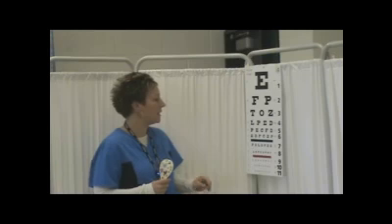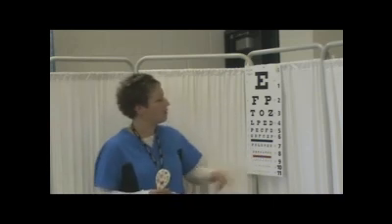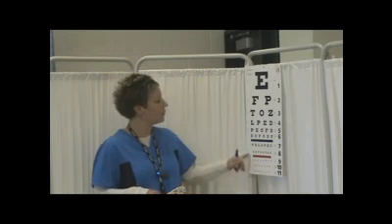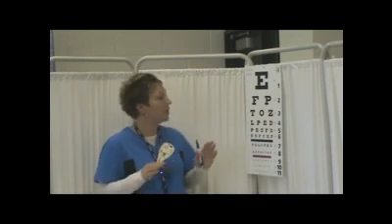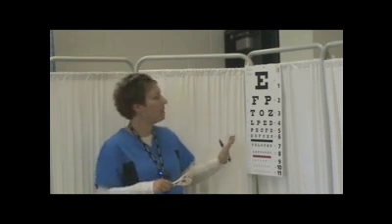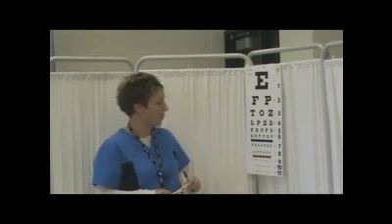For example, if I have a client who is able to read clearly without straining or leaning forward at 20/20 and misses one letter, I would record that as 20/20 minus 1. That tells us the client is able to read the 20/20 line with the exception of one letter. We do that for each eye individually. It is only important to record each eye individually on the report card if there is more than one line differentiating between the two. Other than that, we assess both eyes together, and that's what we record.